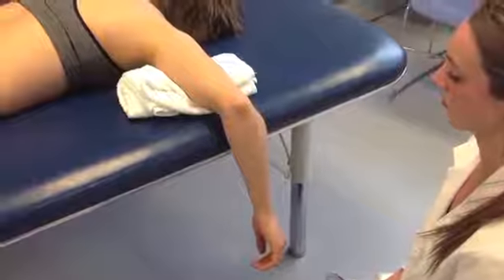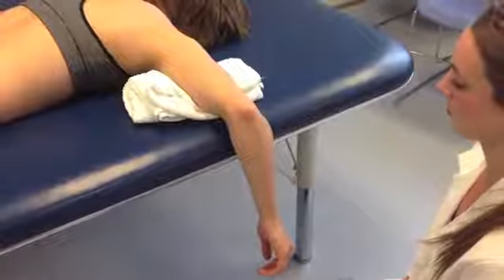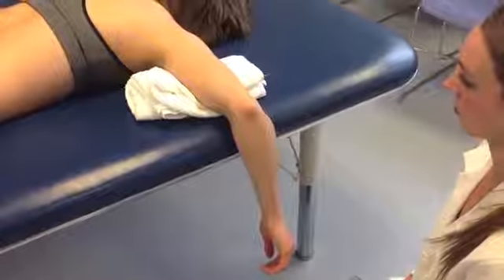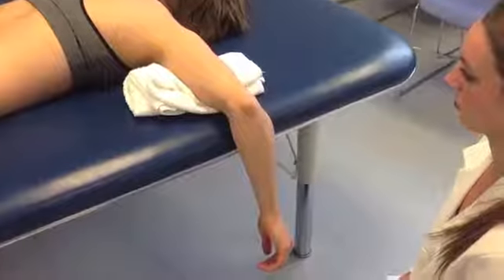Documentation through normal range will be written as 0 to 90 degrees. If active range of motion does not equal passive range of motion, the patient should be moved into supine position in order to test the range of motion in a gravity-eliminated position.